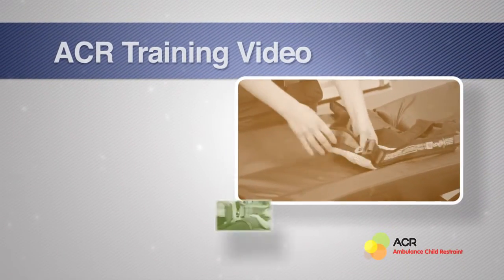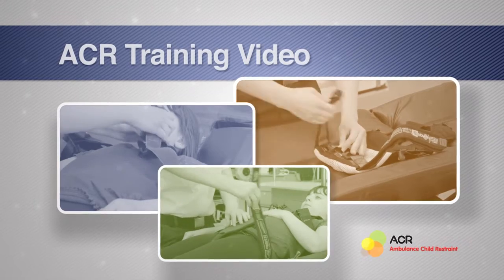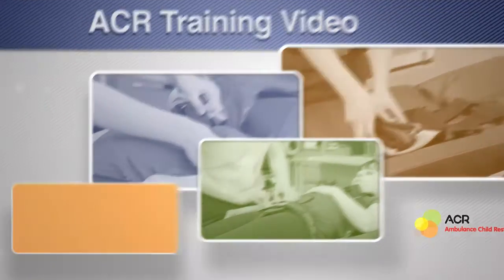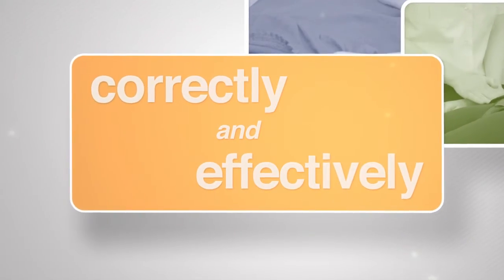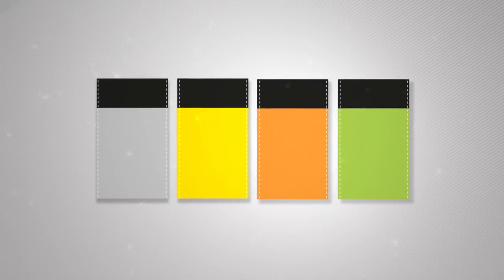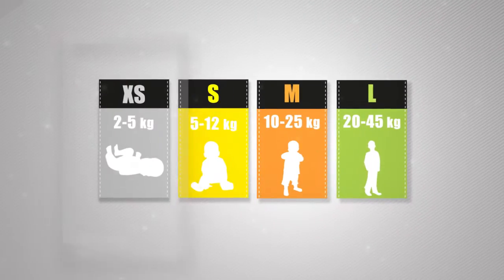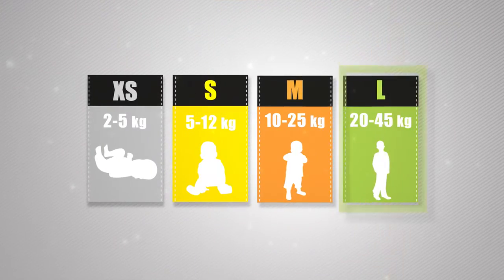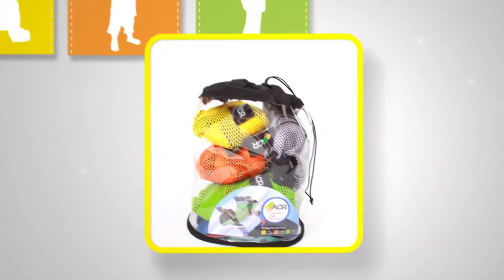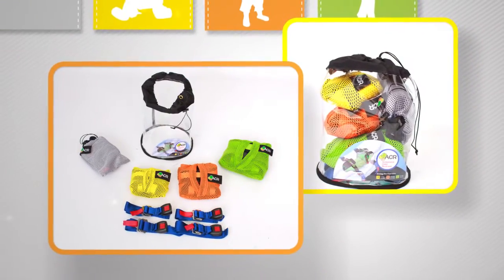This is an ambulance child restraint training video. Follow this simple guide to ensure you are using the ACR product correctly and effectively. The ACR comes in four different sizes: extra small, small, medium, and large. They are color coded so that they are easily distinguishable. Inside your ACR compact storage bag you will find the following items.